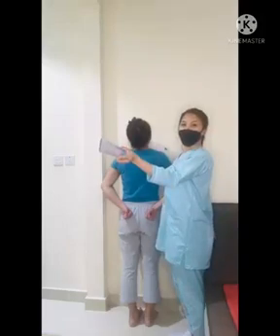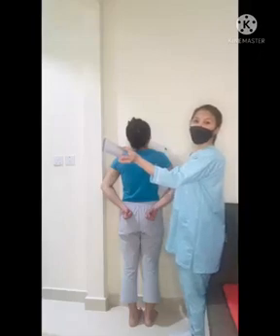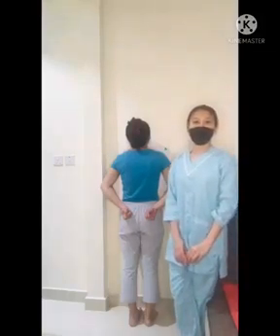So, suspend at full expiration to elevate the diaphragm. The structures shown in this projection are the lower anterior ribs below the diaphragm.